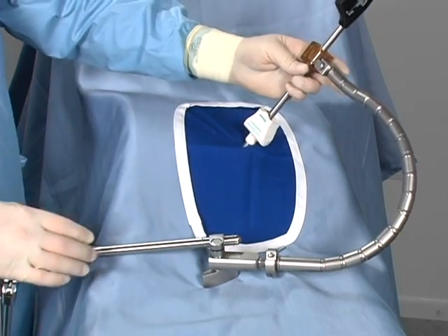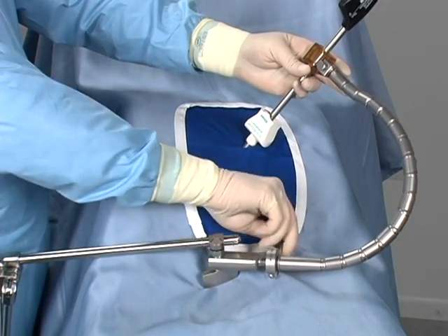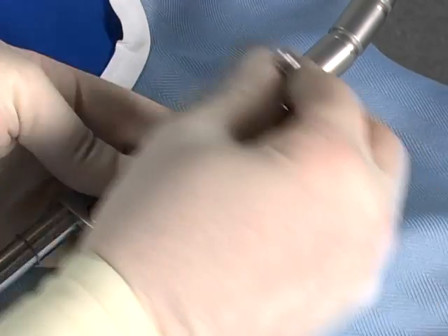The degree of stiffness of the FlexBar's arm is controlled by turning the lever at the base of the arm. Turning the lever clockwise makes the arm more rigid.